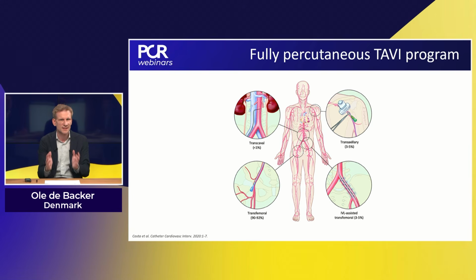So this is just an example. Again, I want to repeat, you have to see with what context you're working, which expertise and skills you have in the team, and then take a decision on that. So maybe one comment, Ole. I absolutely agree and would highlight the discrimination between puncture site and vasculature in order to assess feasibility. Because I think this is much more important than the extent of the disease or even severity of calcifications.